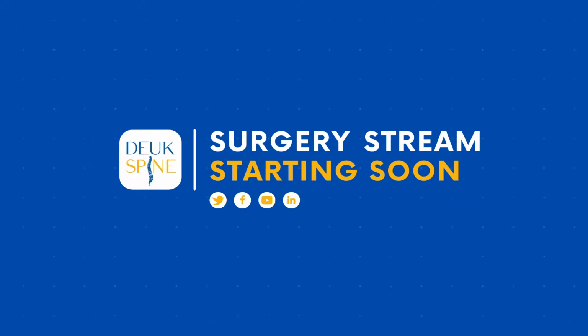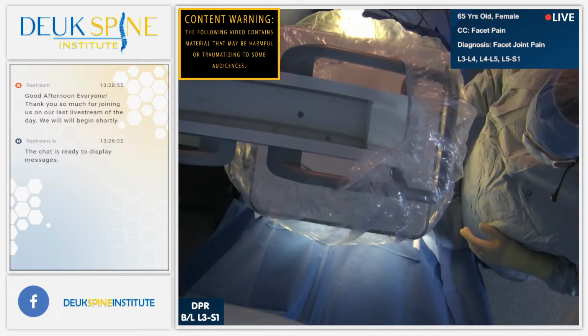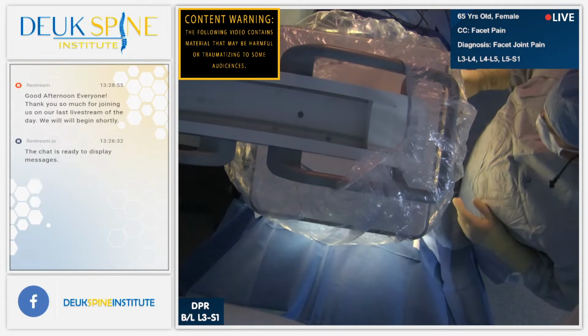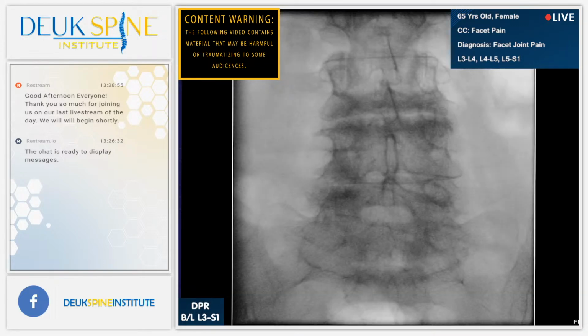All right, welcome to the live stream here at Deuk Spine. This patient presents to us with back pain. She's had it for a long time, and she had originally had her discs treated. She had herniated discs, and now she presents with facet joint pain. The facet joint pain is really bothering her. She's getting more active now that she had her discs fixed. So we're treating the facet joints today.